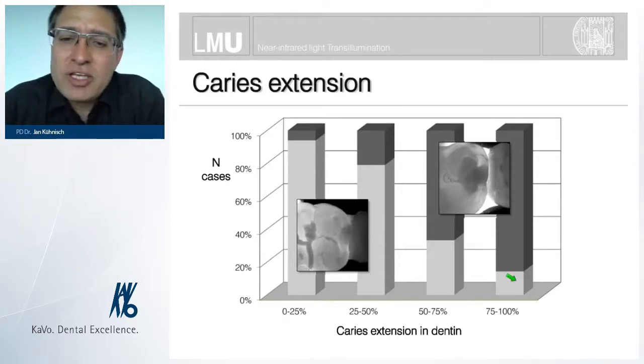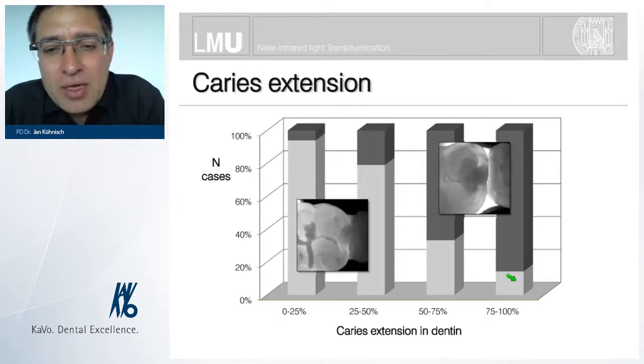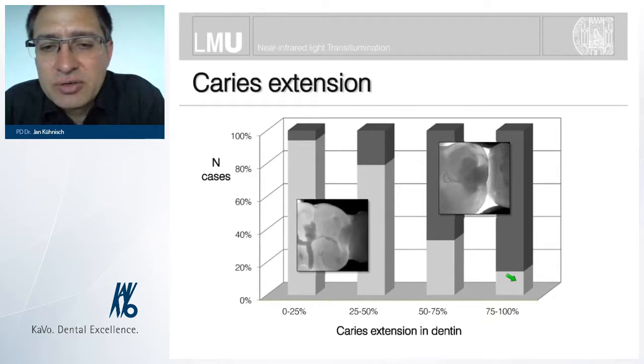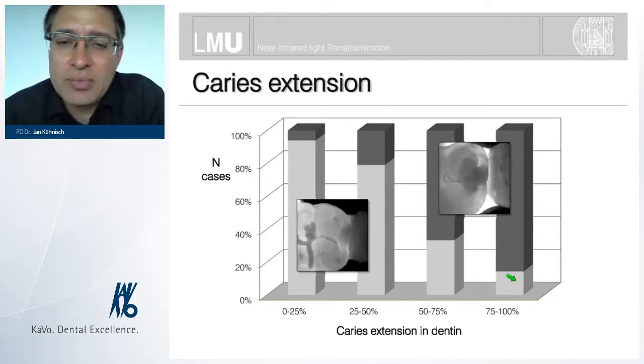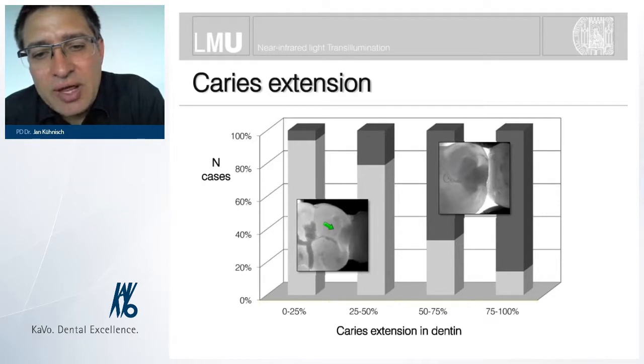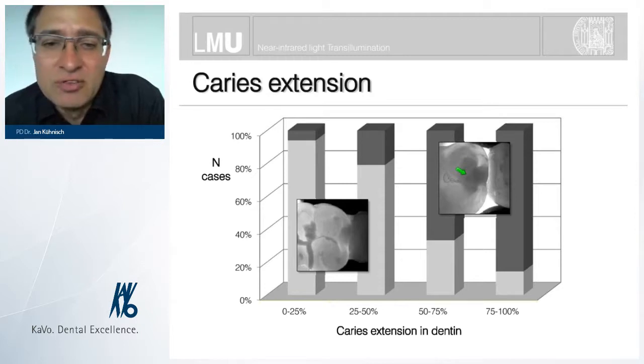I will give you some more information regarding the different content of information from lesions like that in comparison to those which are clearly visible in dentine. I think we can differentiate these two stages where we have an indirect hint that the dentine caries lesion is present. In these cases where we are seeing a dark shadow, it is very clear that we have dentine involvement.